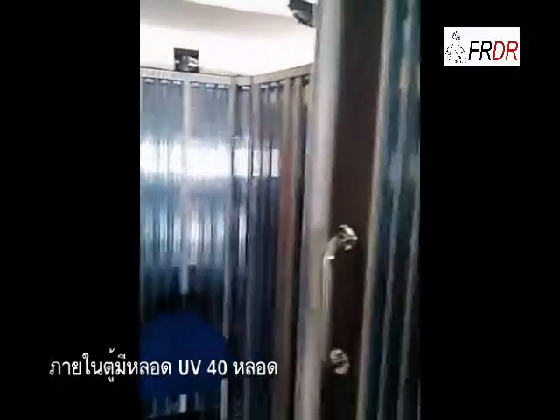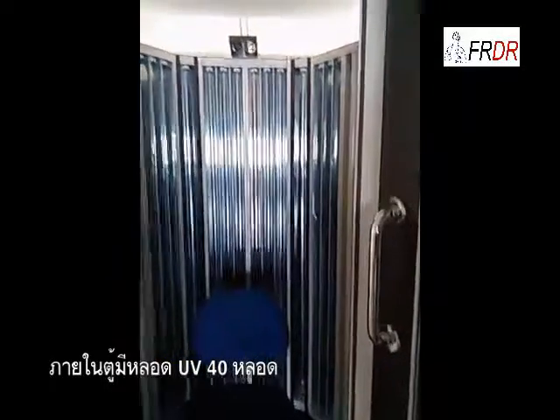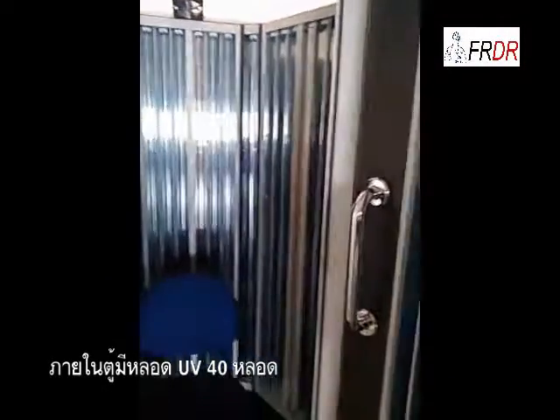This whole body chamber is equipped with 40 units UV lamps, UVA or UVB. For this device, we equipped UVB lamps.